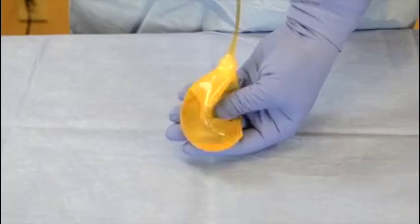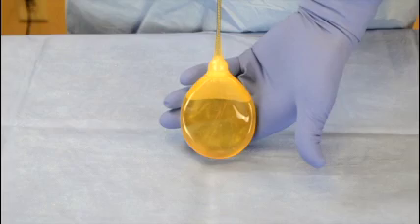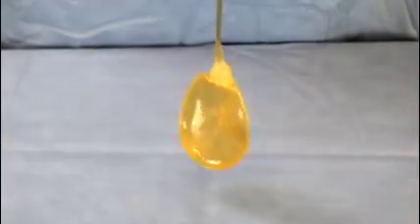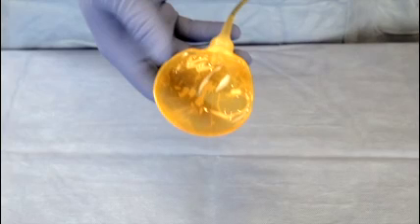Using your thumb, press in on the side of the reservoir to form it into a bowl shape. Aspirate all remaining saline and air out of the reservoir and into the syringe, stopping when the syringe plunger encounters resistance or reservoir makes a flattened bowl shape. Leave in the flattened bowl shape.